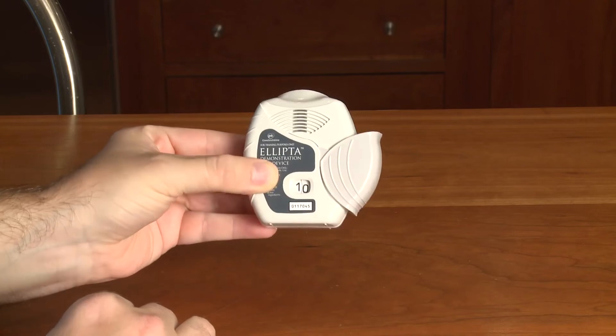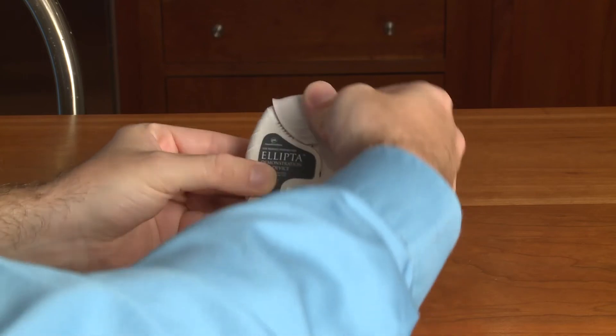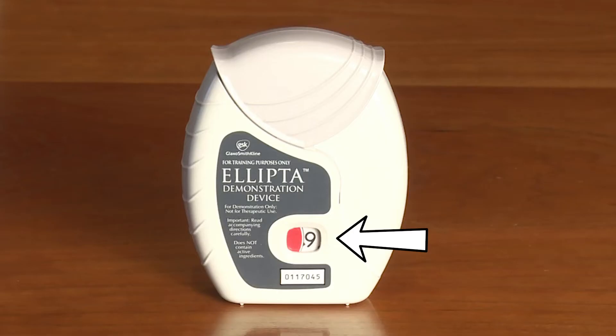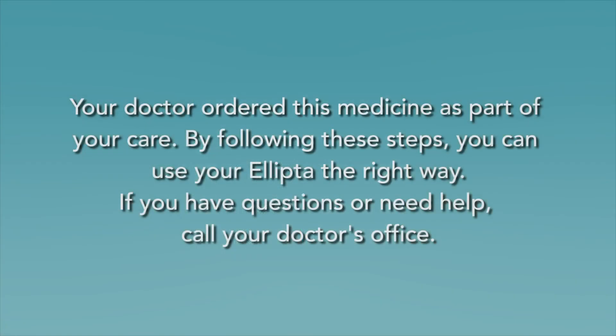Close the Ellipta when you are done taking your medicine. Keep it closed until the next time you use it. Hold the outer case with the mouthpiece pointing up to close it, then slide the cover up until you hear it click. Check your Ellipta counter after every time you use it — this tells you if there is enough medicine for your next treatment.